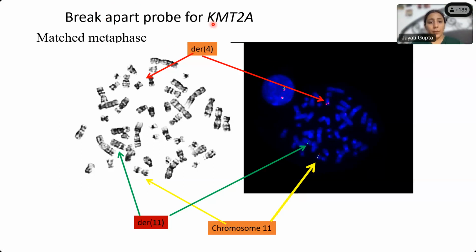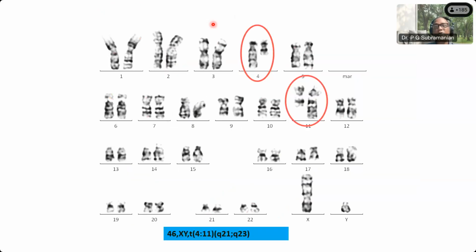So a chromosome banding is done and it is showing you a 4;11 translocation. The 4 chromosome, this is the one which has undergone translocation. It has lost a piece here. That has added into the normal 11 chromosome, and you're having this. So normally the chromosome numbering, just for people who are uninitiated, just broad. I am not a cytogeneticist, but just some broad principles.